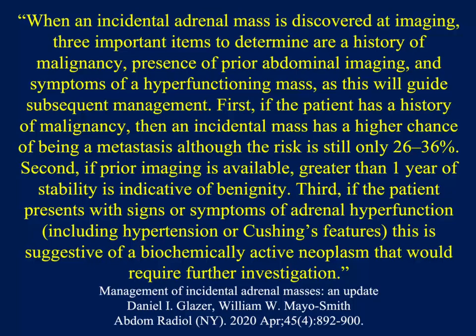And with that, that's the end of the 4th part of our look at the adrenal masses, looking at some of the challenges. Again, it's important to know the rules and know there are exceptions to the rules. And I think if you follow the rules, you do really well.